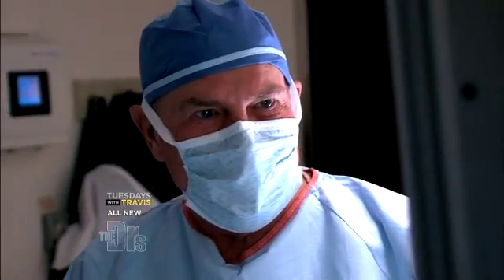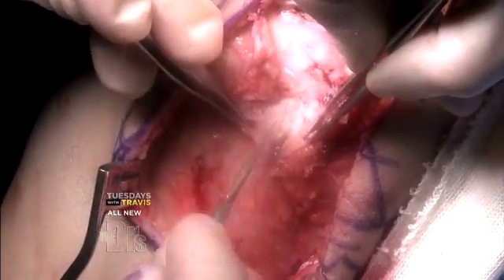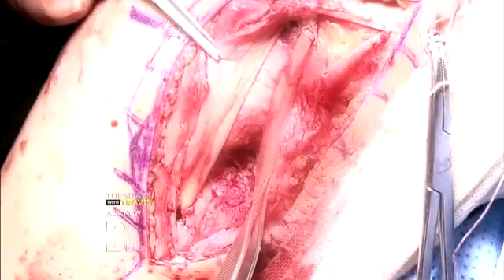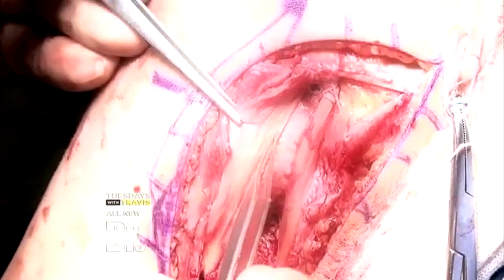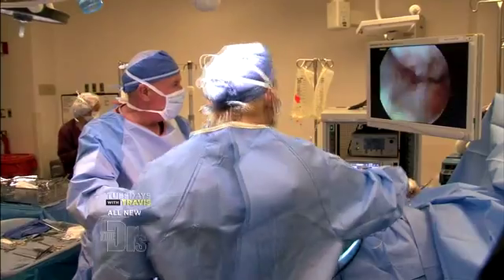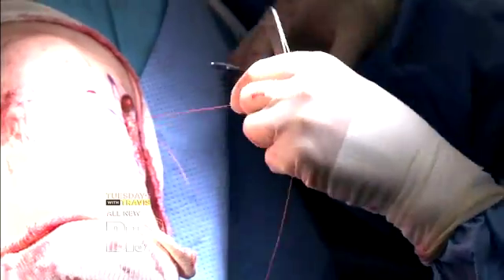Now we're going to address the LCL with the scalpel. This is where the tendon was torn, and this is where we're going to put our tunnel. We pull them through into the tunnel we've created — the two bands go down through the fibula and come out the other side, forming a triangle. We put in an interference screw, check our range of motion, finalize the fixation, and we're good to start closing.